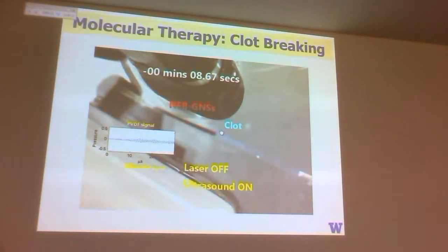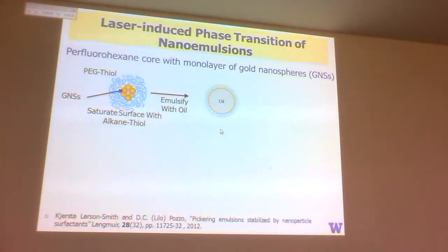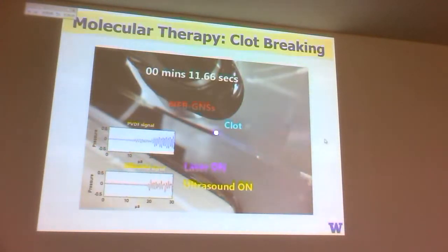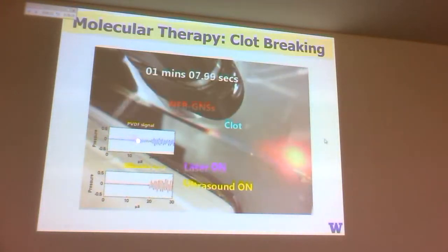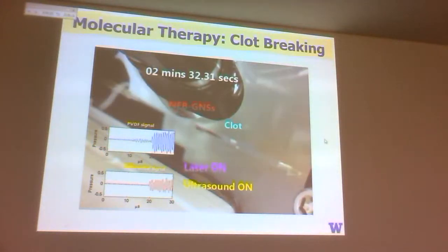But you're synchronizing the light delivery so that you'll be in the negative phase when you're in the center of that clot. Okay? So when that light is delivered, whoops, sorry. Didn't play automatically. Okay? You can see here, so there's the ultrasound signal that's from before, because it's before the light got there. So that doesn't change at all. When the light's delivered to the central region in the clot, you can bust the clot very, very efficiently and effectively.